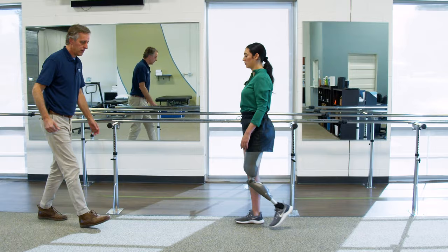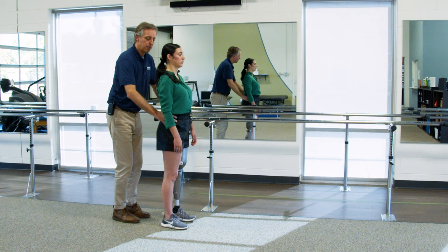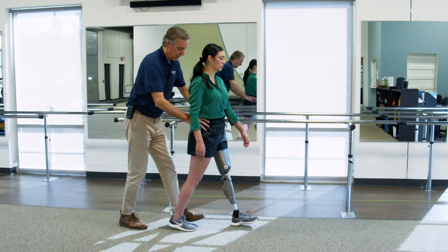Now turn around. So if I'm walking with somebody out here and I'm going to work with them, I always want to start with what's number one, weight on the prosthetic. So I'm going to push her a little bit into the prosthetic side. Tracy will tell you I'm pressing down on that left prosthetic hip, really getting her load, because that's where we're going to start, right? Number one for us is always get load on the prosthetic. Once she's got that, number two is get the pelvis moving. So we load the prosthetic, take a step with your right foot, pelvis goes forward, and we start walking. Just relax and walk. There you go. Good. Turn around.